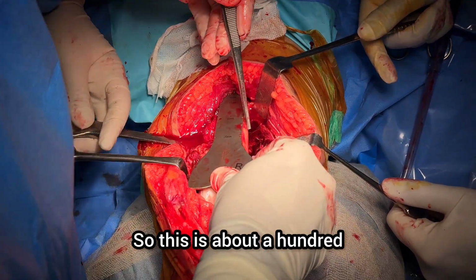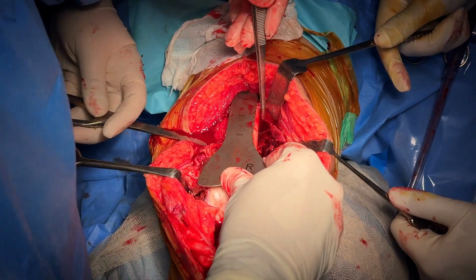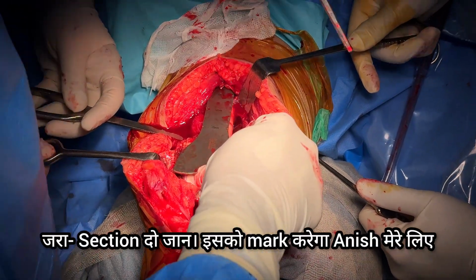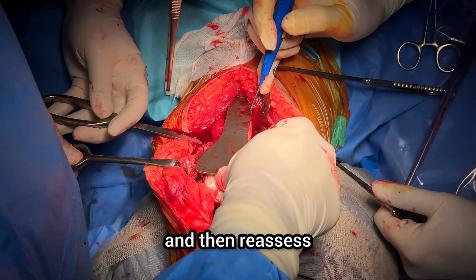So this is about 100. We can go 110, 120. I'm going to go around about 120. Around about here where we marked. Will you mark this again for me? Mark this for me. Sir. This is where we're going to resect and then reassess.